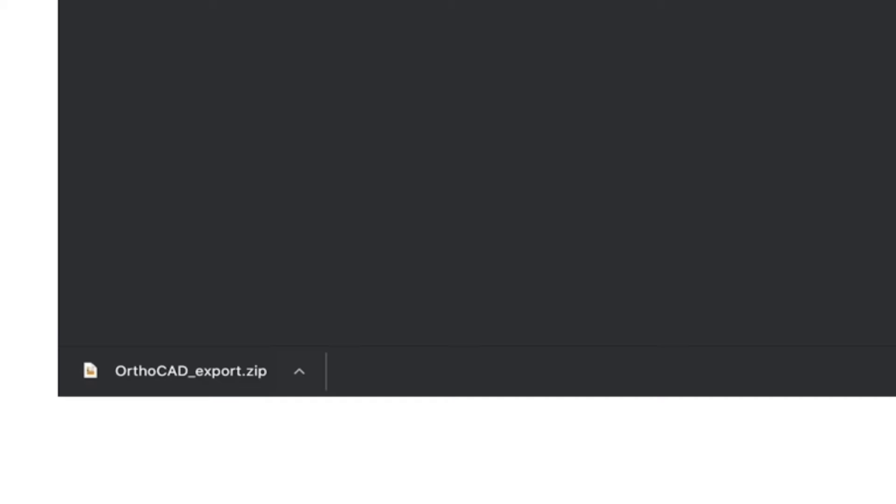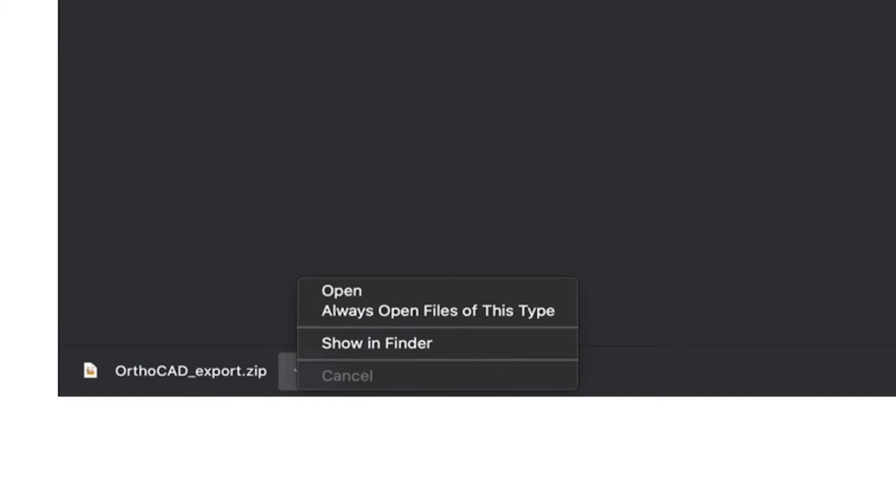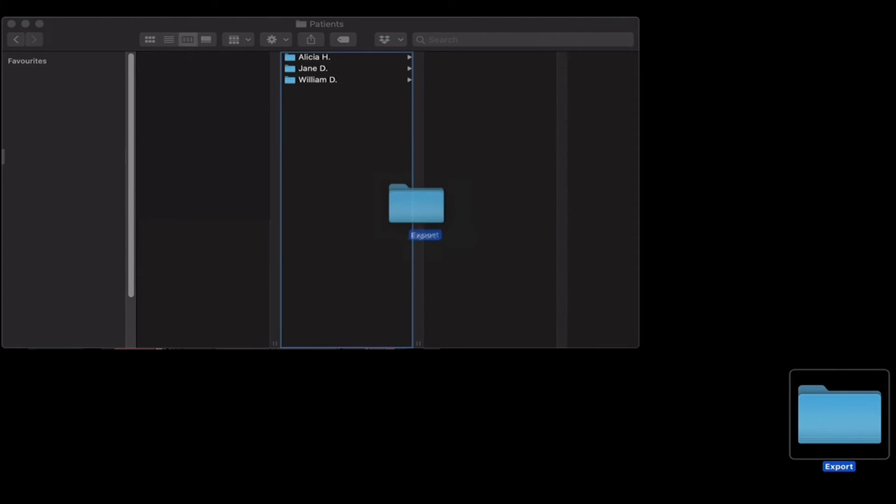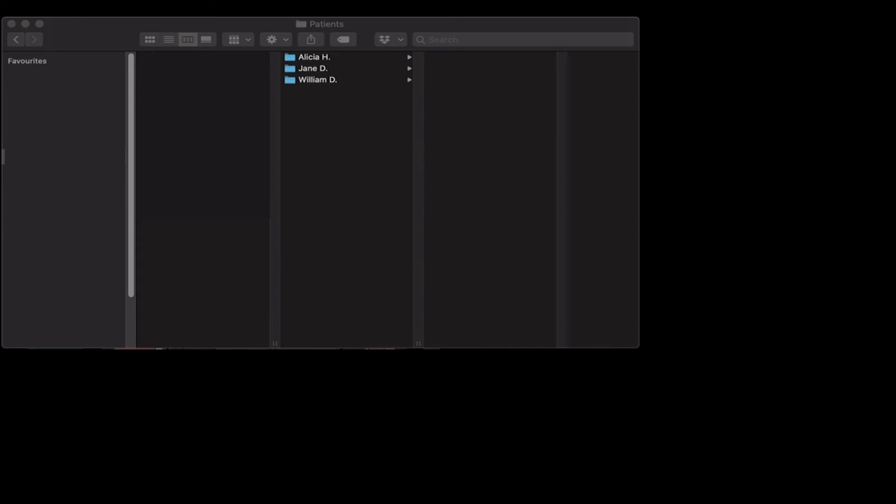Once the export is completed, your files will appear in a new window or in the bottom bar of the browser. Check your browser's settings. You can then choose to copy and paste or simply drag and drop the scans to your patient's folder.